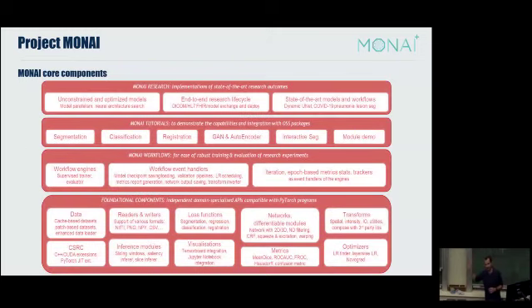I'm not going to go through that, but basically MONAI is organized into multiple repositories, and I'm showing you some of the components that constitute MONAI Core, which, as the name suggests, sorry, is a bit of a lack of creativity here. It's core, the repositories that all of the other ones build on. So if I start at the bottom of the screen, without reading them, we've got basically our Lego bricks, all of the different components. I will have the different architectures, the different losses, the different optimization schemes, the different schedulers. I will have anything I can: all of the reconstruction algorithms, all of the transforms, everything is in there.